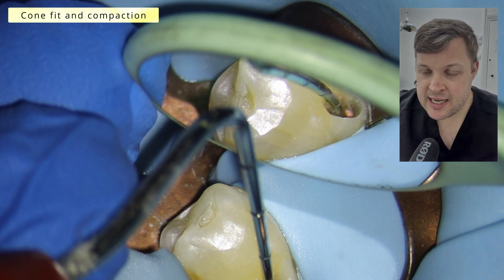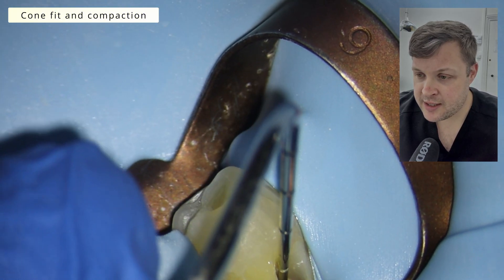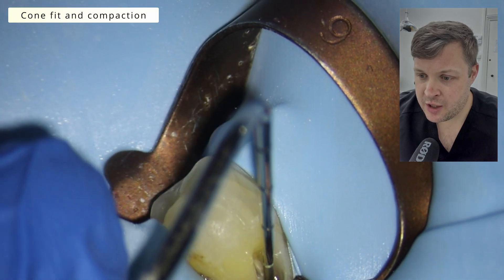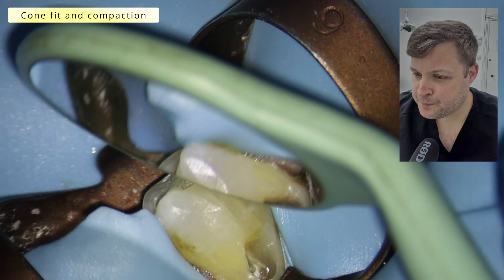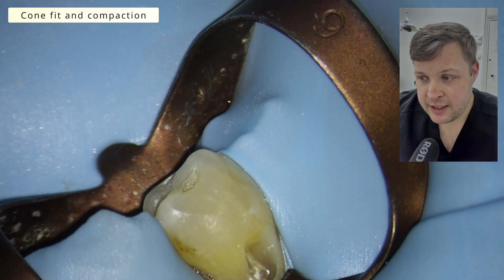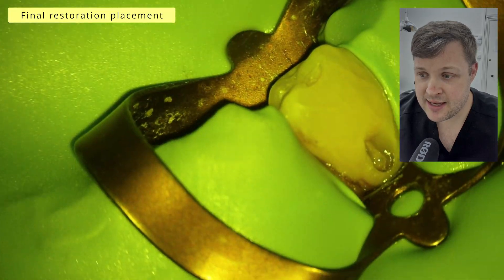A lot of the time I have to make sure the patient is aware I'm going to push down quite hard. I'll give it a good push, let the patient know — super nice. That's the root canal done. I'll take an x-ray to see if the compaction is satisfactory, then fill the canal with composite, and overall it looks pretty nice.